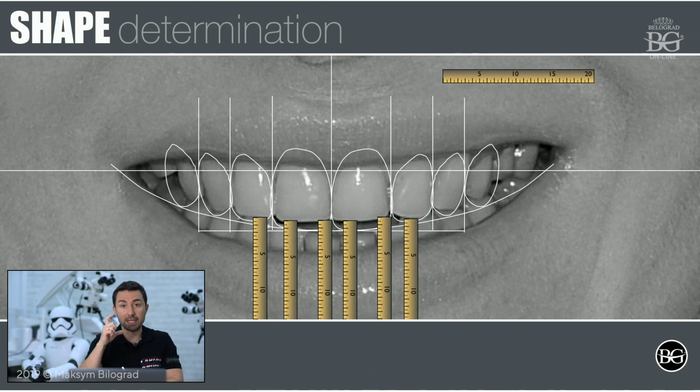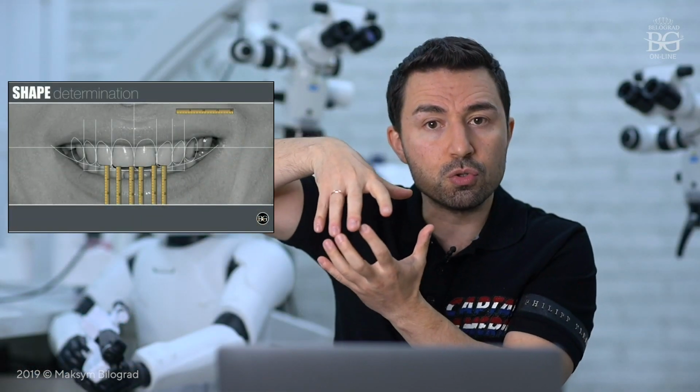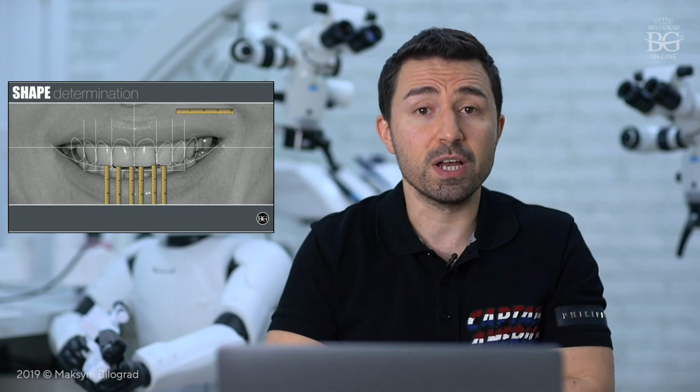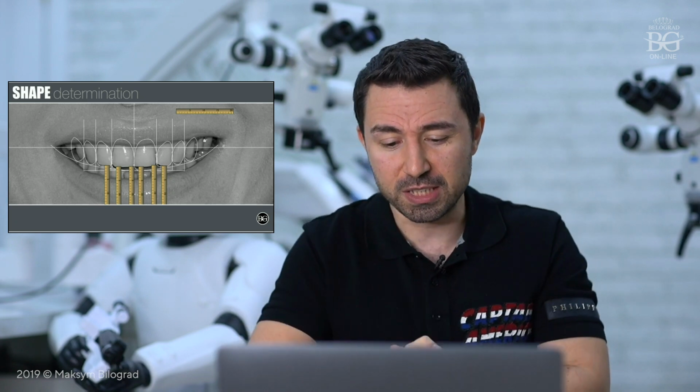So when you understand the length of the central incisor, and your dental technician also understands the length of the central incisor, we can build up occlusion. When we mount models into the articulator and mount the lower jaw, we make a proper overbite, and then we go into occlusal rehabilitation because we'll have some space. But this is another topic, not about this, just about this case.